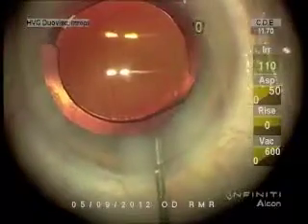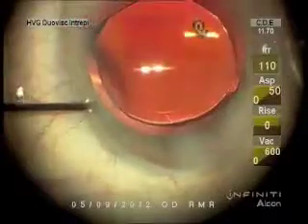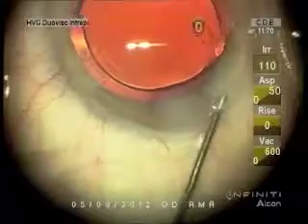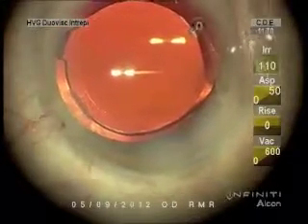After hydrating the wound, I like to just make sure Descemet's membrane is not folded here at the inner lip of the incision. Then hydrate the paracentesis a bit. I think our main incision isn't sealed yet, so we'll hydrate some more. And again, make sure that inner lip isn't rolled. I like to get the eye really firm, and then confirm the incisions.